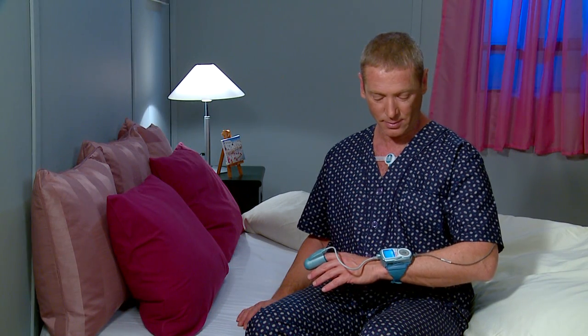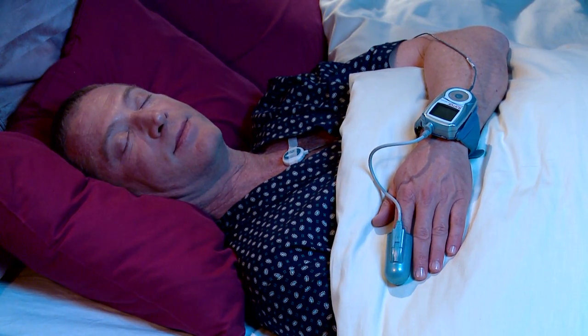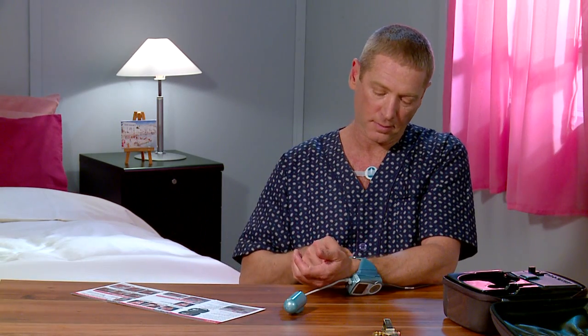WatchPat is now working properly and it's time to go to sleep. In the morning, remove the PAT probe from your finger, then remove the device from your hand.